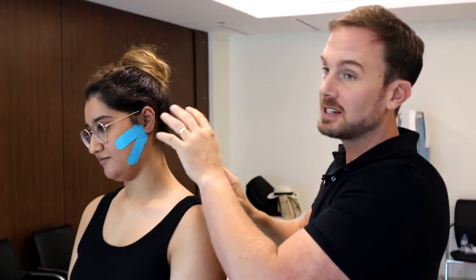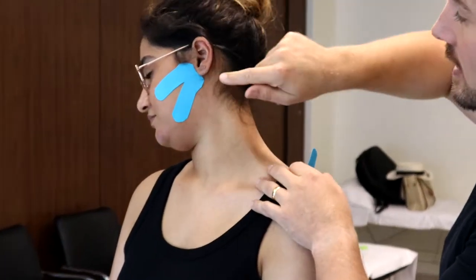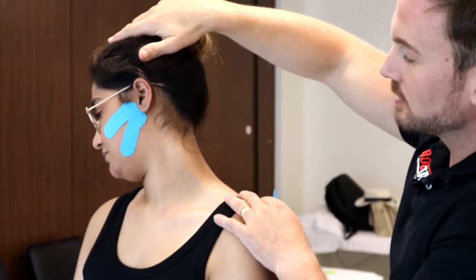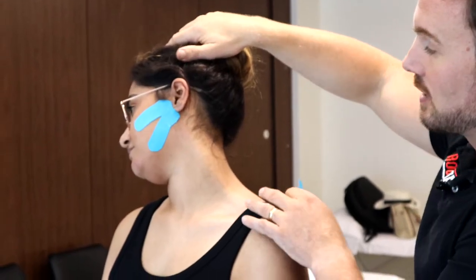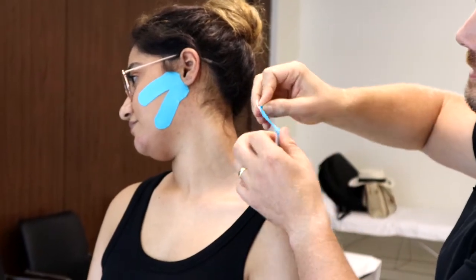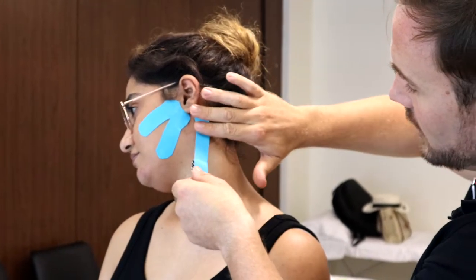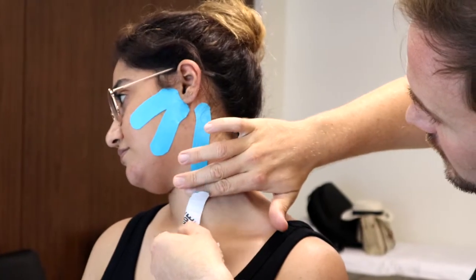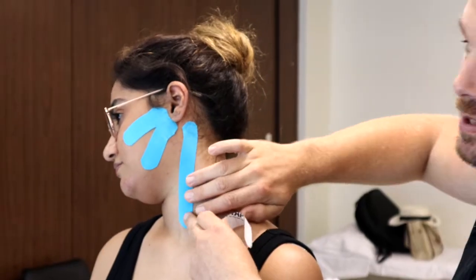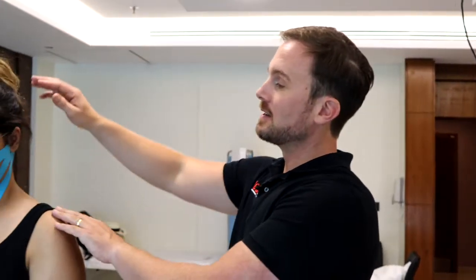TMJ issues are not always related to the TMJ area directly — they can be influenced by other parts of the body, in particular tension around the neck. So the next technique is for the sternocleidomastoid, the SCM. We get our patient to turn the head and stretch back a little bit into extension, just as far as is comfortable, allowing us to apply the tape over the SCM region. I've cut the tape to be nice and thin so it's not too uncomfortable. Starting just around the back of the ear, track that down over the SCM region heading towards the sternum — with no stretch on the tape. The patient is stretched, the tape is not stretched. This was also noted in a research study.